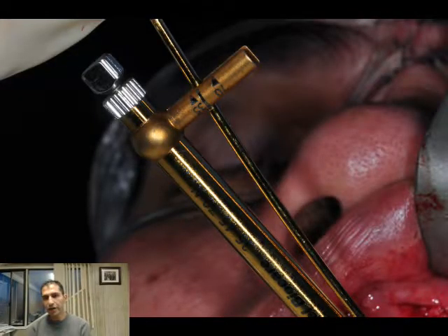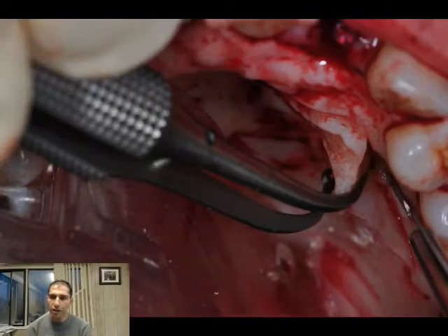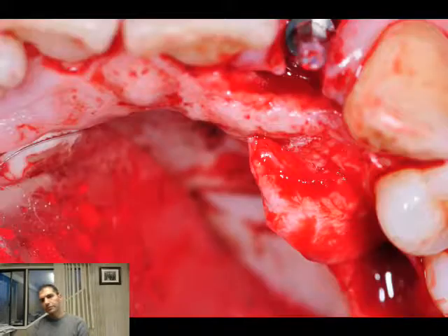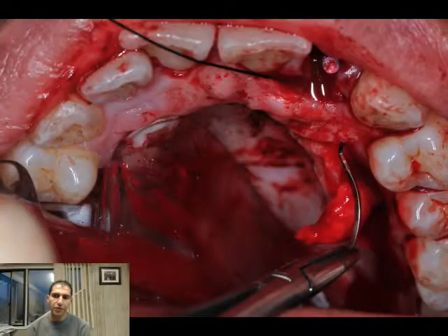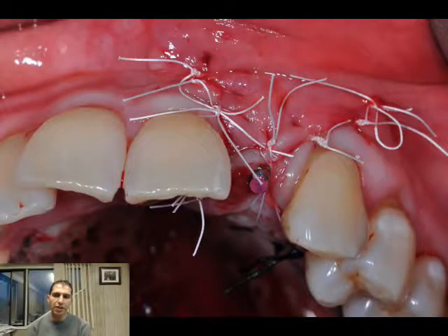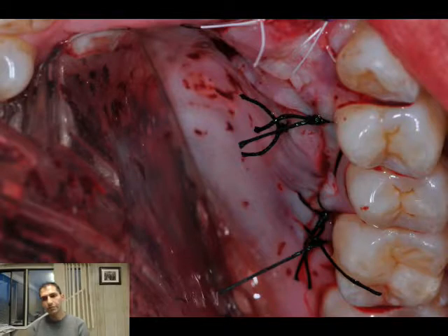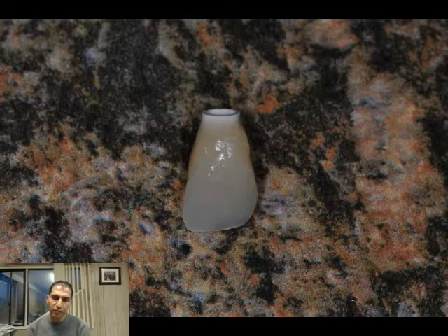We achieved very nice torque on this implant placement, so we decided to go right away for immediate temporization. Here we harvest connective tissue through the palatal area — we're going to suture it and it will go underneath, staying attached to the palate. This is the closure and this is the provisional.